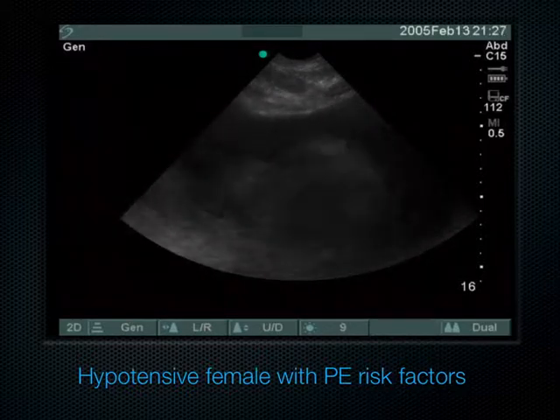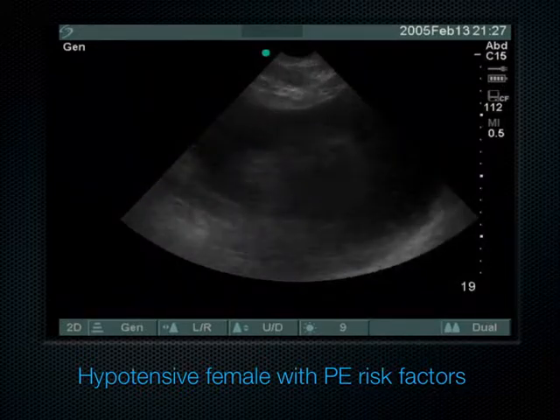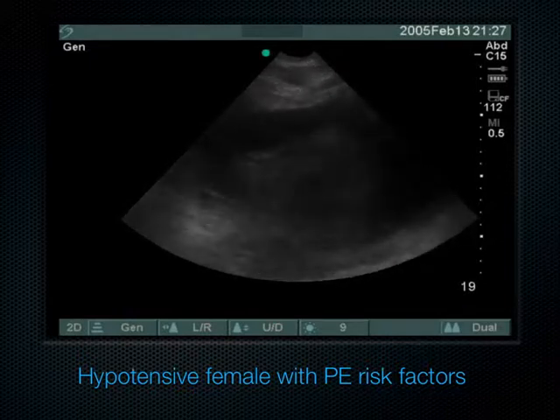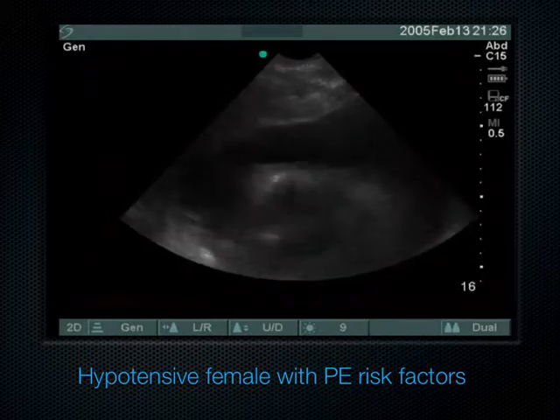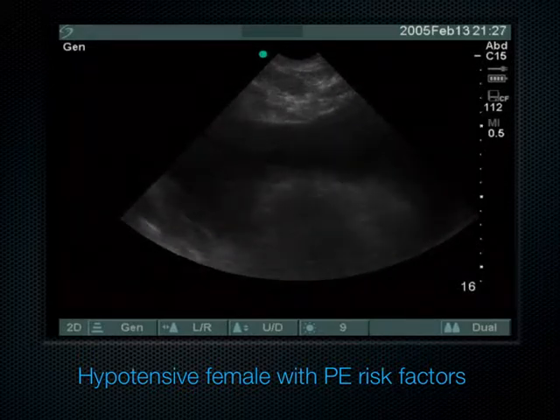Wah, wah, wah, wah. So, excuse me, nurse, did you already push the thrombolytics? No? Good. Because that would have been the exact wrong thing to do, right? What does this patient need? Pericardiocentesis. So, this was a real case.